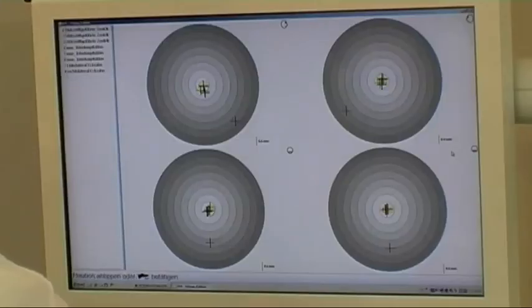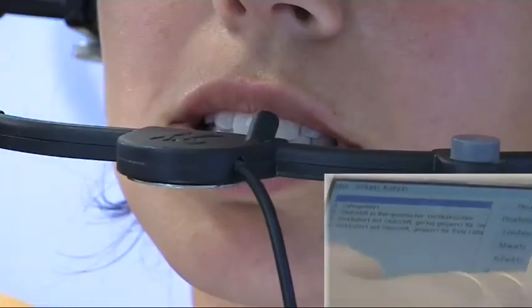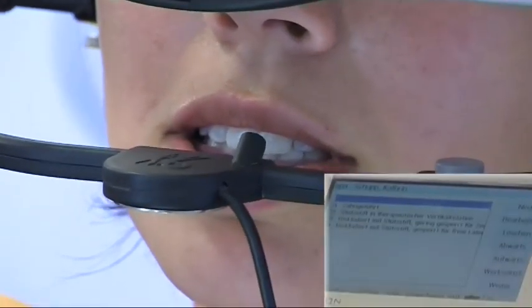The measured position is accepted by pressing the OK key, and we can then enter our comments. By pressing the OK key again, the data is stored and we return to the main menu.